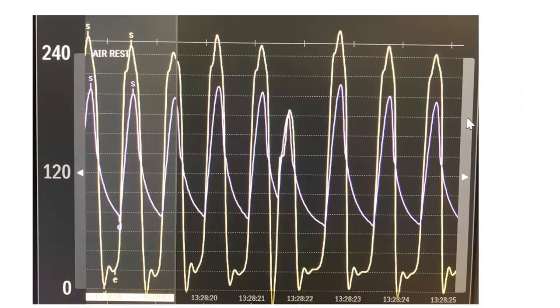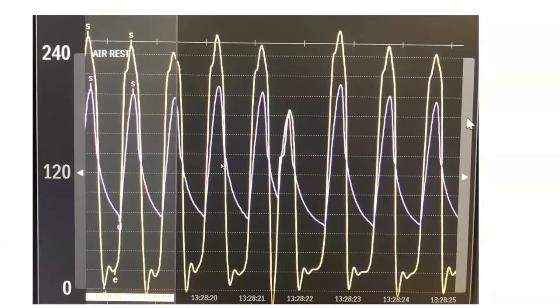Here is another case — please give your answers. If you look at this recording, you have a very wide aortic pulse pressure and no anacrotic notch. The LV and aortic pressures are not hugging each other but are not very far apart either. So it is wide pulse pressure, definitely no pulsus parvus, and no anacrotic notch — it does not fit with aortic stenosis. Yet you have a big gradient of over 40 mmHg, with each box representing 20 mmHg. So what is the diagnosis?